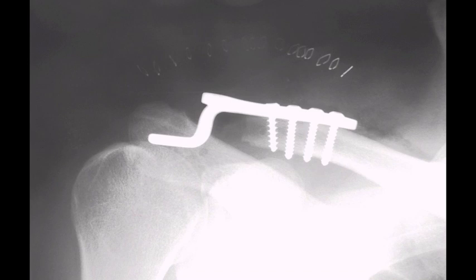There are many other operations that can be used to repair a dislocated acromioclavicular joint. In this operation, a special plate is attached to the end of the clavicle and hooks underneath the acromion to hold the clavicle back firmly into place.